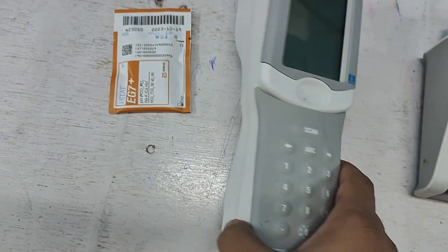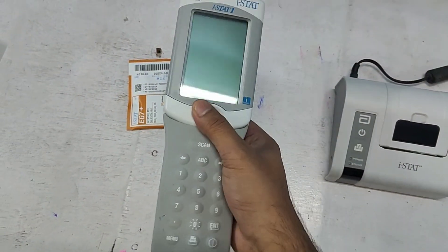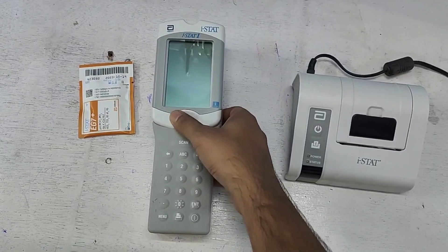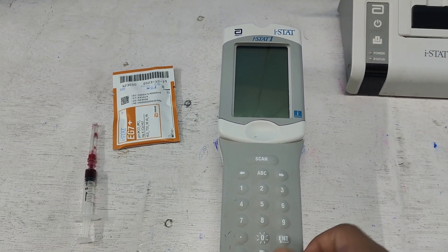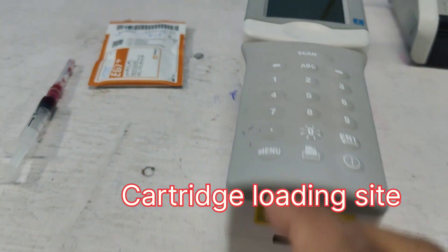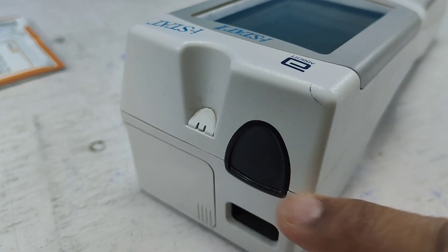The market price of this machine is approximately 3.5 to 4 lakhs — it is very small and handy. Now I am going to perform the ABG test on this machine. This is the display, and this is the slot in which the cartridge is loaded.